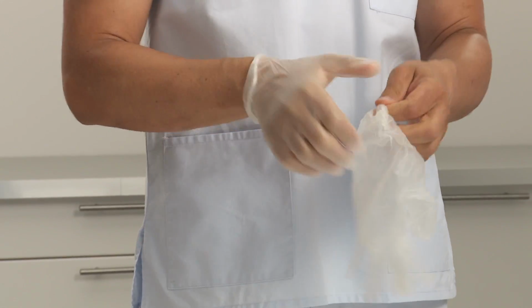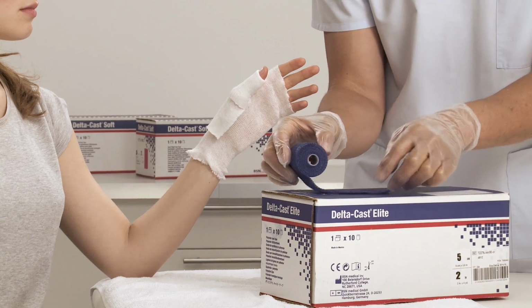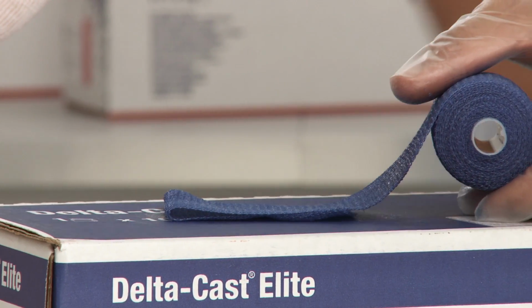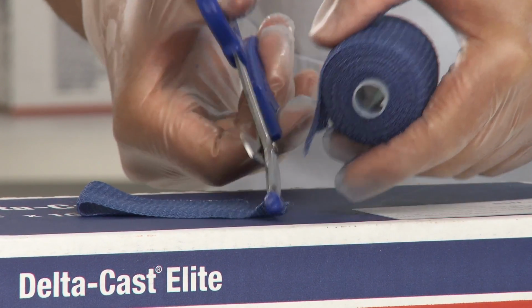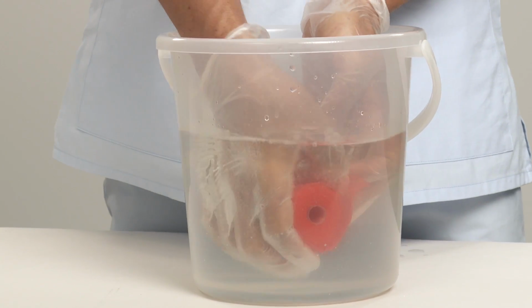Put on protective gloves. To prepare an optional reinforcement strip, measure the length from wrist to just above the first carpo-metacarpal joint. Layer twice, cut and put aside. If stronger reinforcement is required, increase the number of layers. Select appropriate width of cast tape depending on the size of the limb.